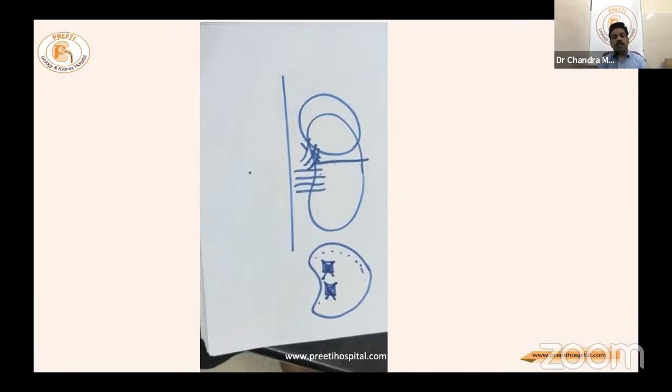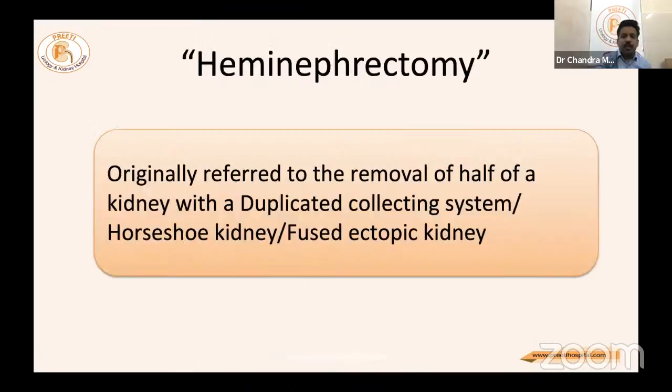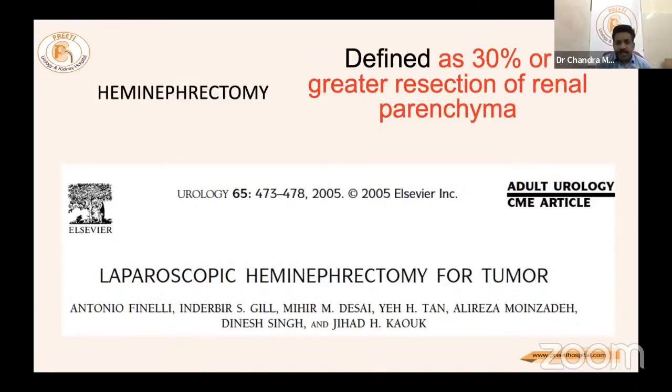With this introduction to the basic surgical technique, the presentation proceeds with three videos: one for upper polar hemi nephrectomy, the second for zero warm ischemia time hemi nephrectomy, and the third for normal warm ischemia time of around 20 minutes. Hemi nephrectomy originally referred to removal of half of a kidney with a duplicated collecting system, horseshoe kidney, or fused ectopic kidney.